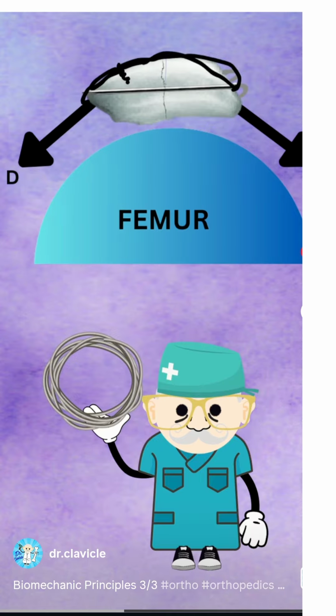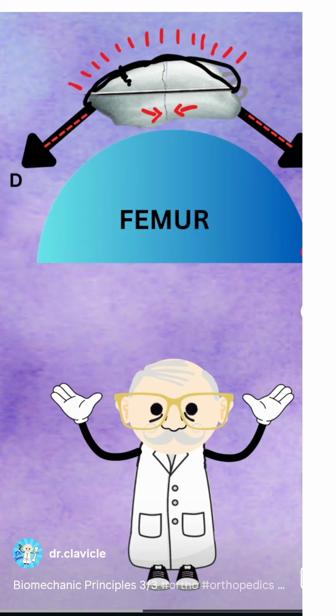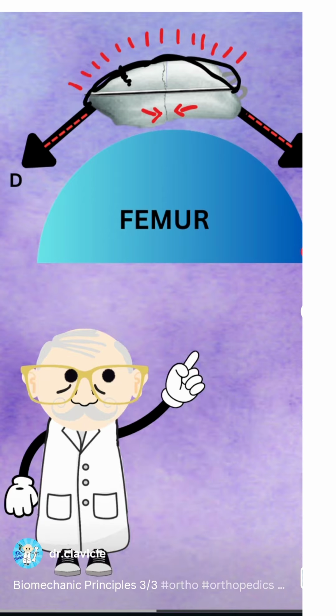However, with a tension band, the implant on the anterior side works like a strap that blocks opening. When the extensor mechanism creates a bending moment, the anterior cortex tries to gap. The wire is put into tension and holds the front closed. Because the front can't open, the same bending load is carried as a pull in front and a squeeze in back, generating compression across the articular fracture surface.